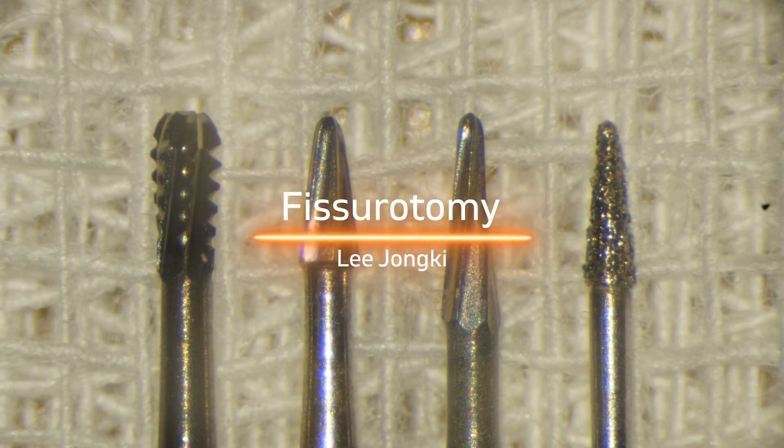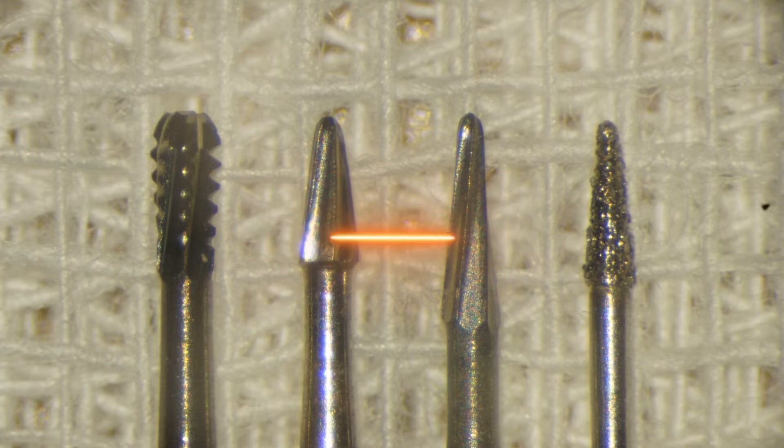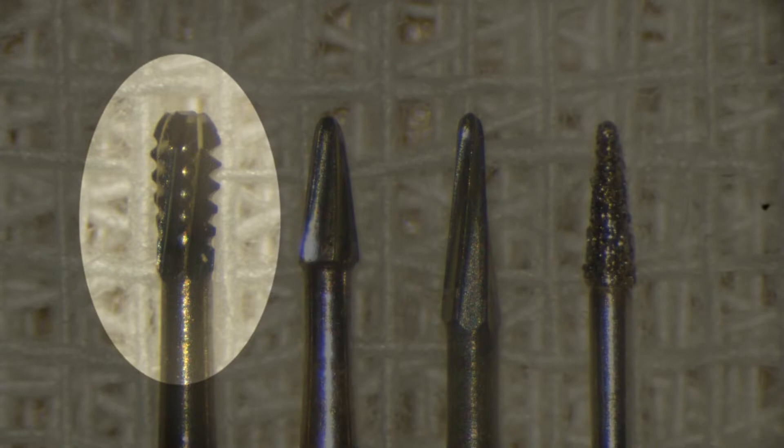Fissurotomy is an excellent way of preventing caries while conserving tooth structure. In this treatment, the burr's size and cutting efficiency are crucial for achieving the goal. This 330 burr, which has a diameter of 0.8 mm, is easily attainable in a clinic, but it removes too much sound enamel.